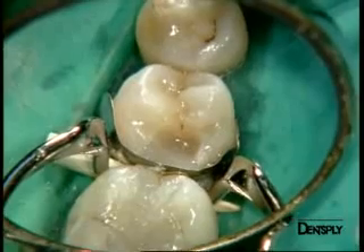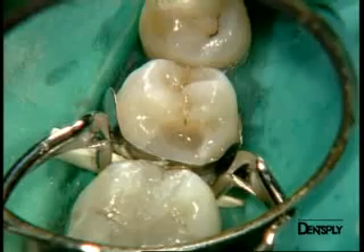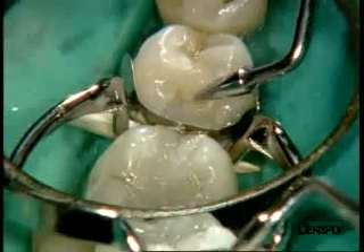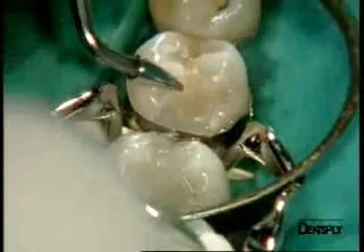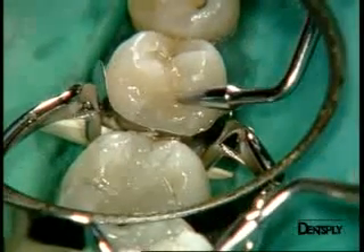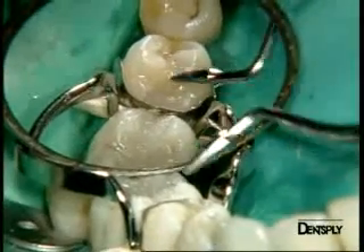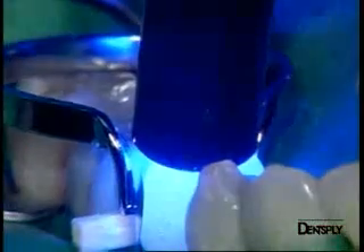On this view, we see the distal marginal crest that is pre-shaped and we now have to rebuild the cusps. We can do the work in one layer using the same Peter Thomas number 3 hand instrument as before. We curve and model our increment to the final desired morphology without the risk of running out of time, as Quicksville exhibits a sufficiently long working time. We then cure.